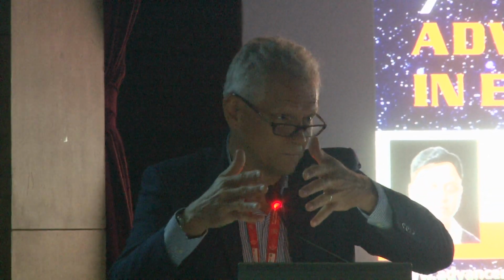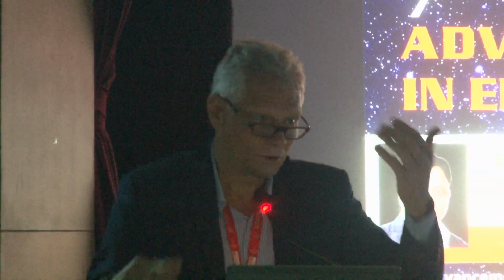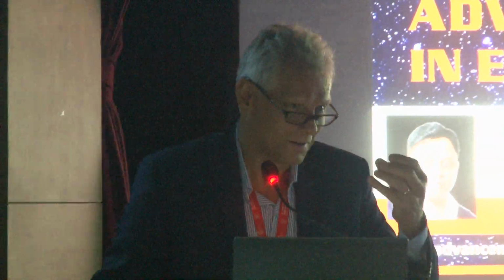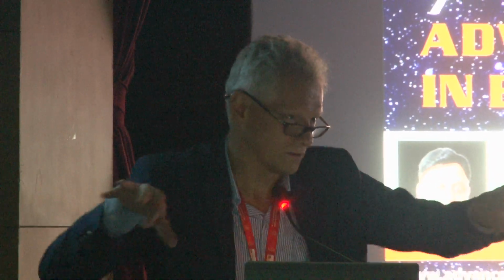You are still preperitoneal, but you have the passage, and it's the same. That's why I'm not talking about the surgery, because it's quite the same. I prefer to do it retroperitoneally, but when I have an opening, no problem. I go on the same way, and I'm just opening laterally the peritoneal pouch.